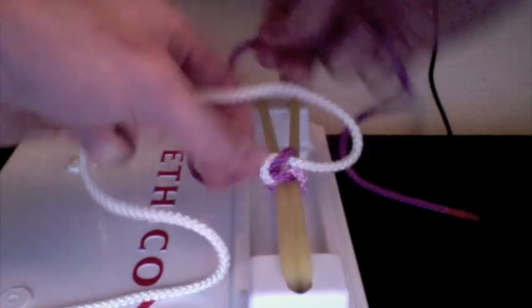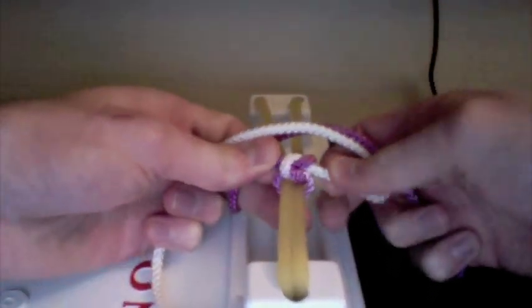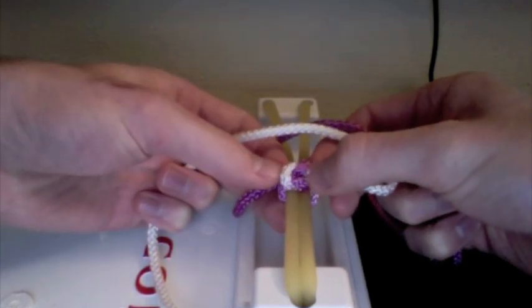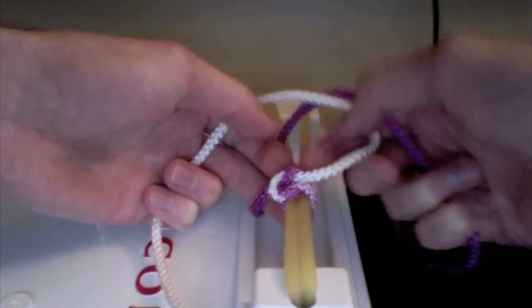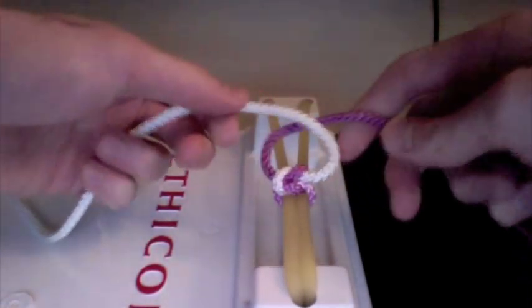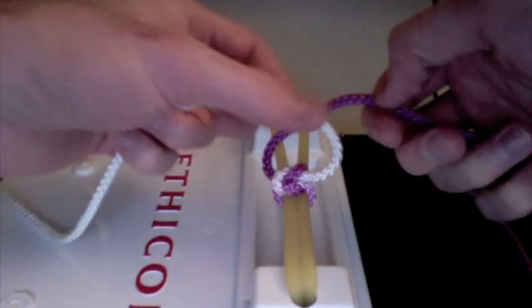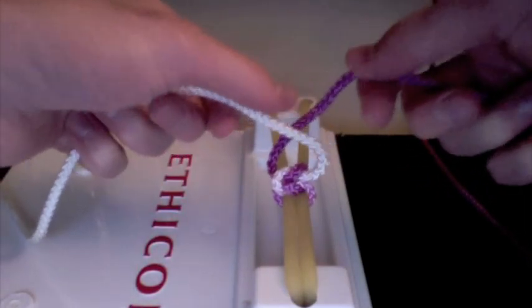You'll notice that this looks like a nice little square knot. To make sure you're doing this right, you should have a white loop here with two purple strands coming out, and a purple loop right here with two white strands coming out. Now that we've uncrossed our hands and tied that knot nice and tight, we have the same setup: white going left, purple going right, and the white strand coming closer to us across the purple strand which is farther away.